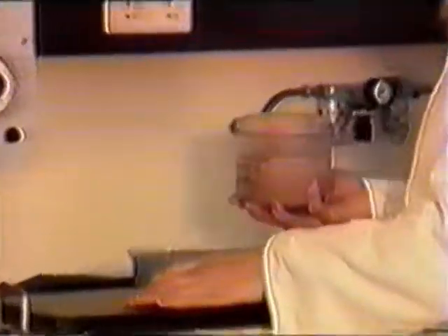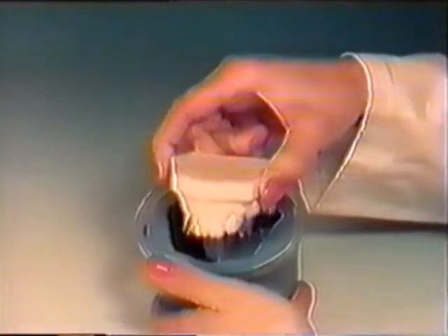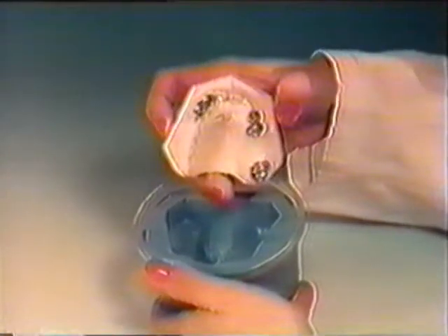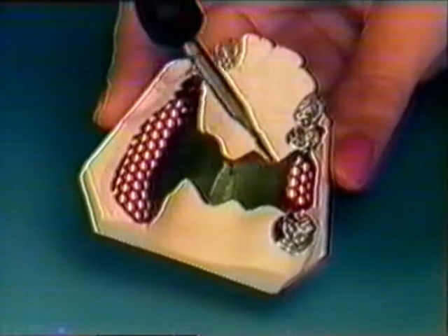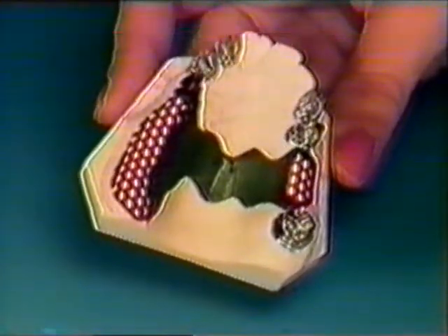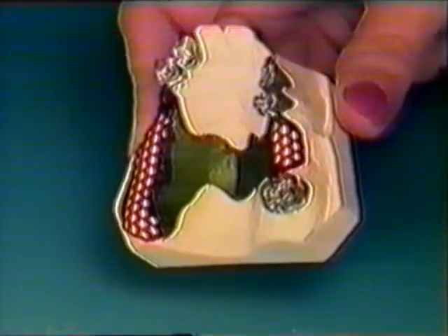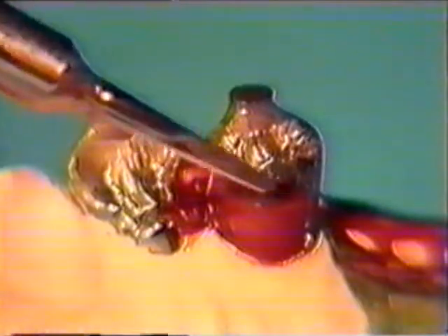The refractory model is cast with REMA-STAR special investment material. After setting and de-flasking, the primary crowns are properly positioned. Dry the refractory model, coat with adhesive, and wax up the framework. The milled surfaces are covered with a thin coat of stress-free casting wax, and then anatomically sculpted with modelling wax.